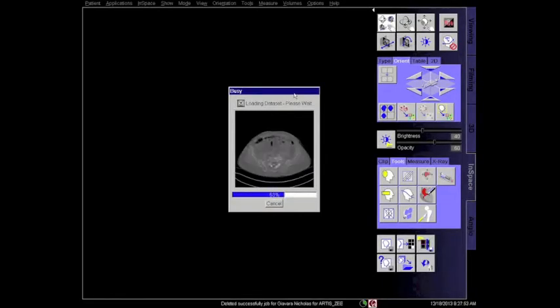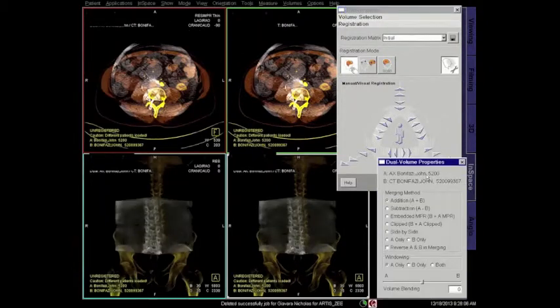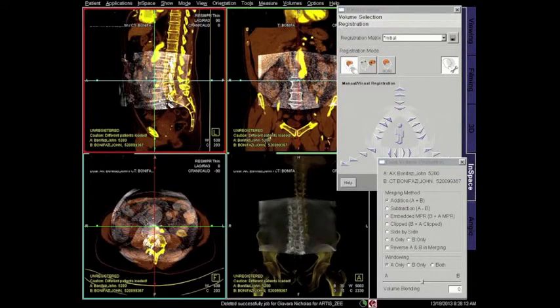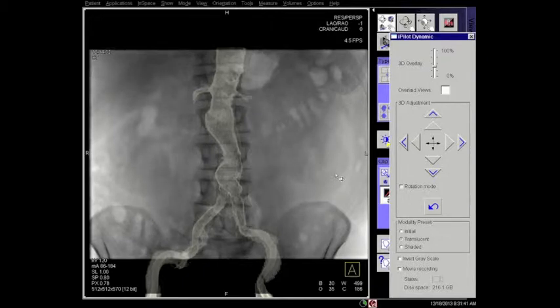At this point, we call in the preoperative CT angiogram and fuse it with the dynamic CT that we just obtained. Using easily identified bony landmarks, we line up our pre-op CT with our dynamic CT and register the fusion. We now take the bones out of view and switch to the preoperative CTA vascular reconstruction view, which is now fused with the on-table dynamic CT. This gives us a 3D fusion overlay that can be used as a roadmap throughout the entire case.